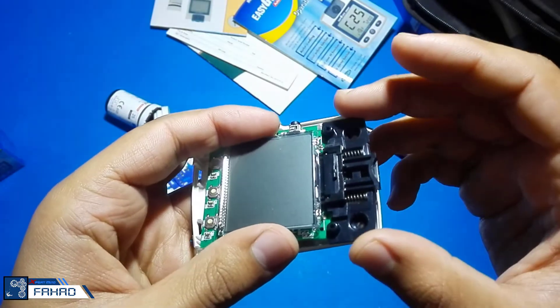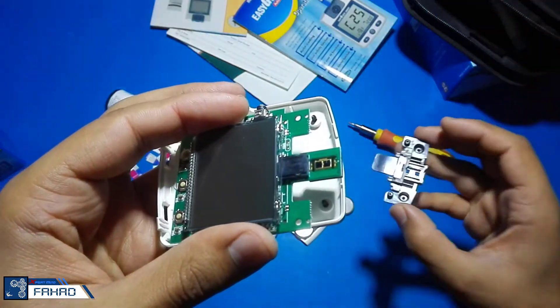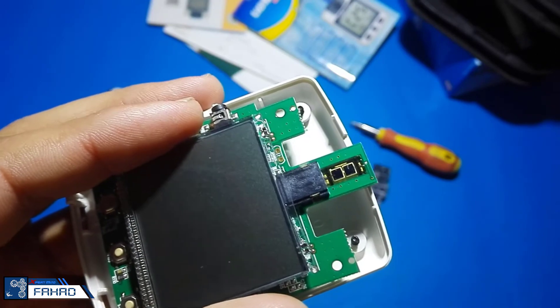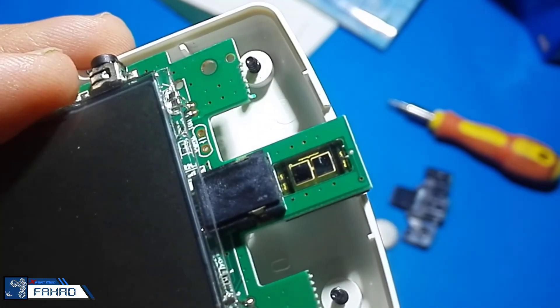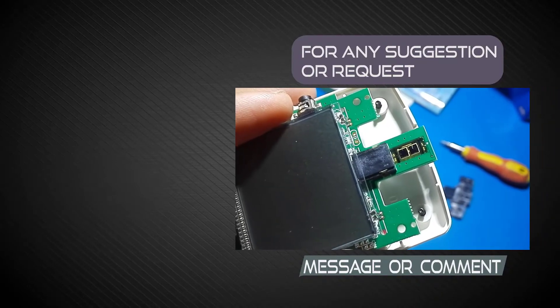I am going to remove the upper cover. And now you can see two rectangular spots — these are the photo sensors which take the ferrocyanide level reading from the strips. From the strips it moves to the board, and the processor processes it and displays it on the screen.